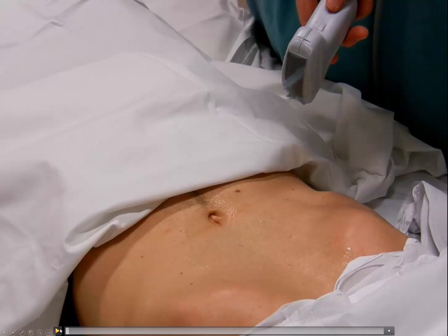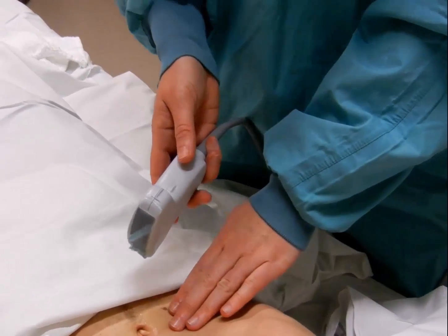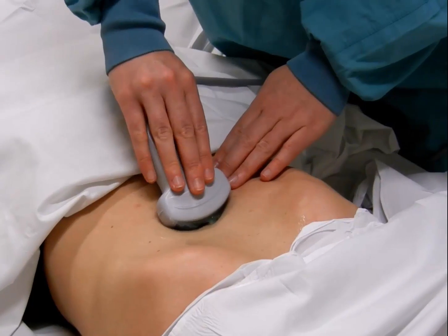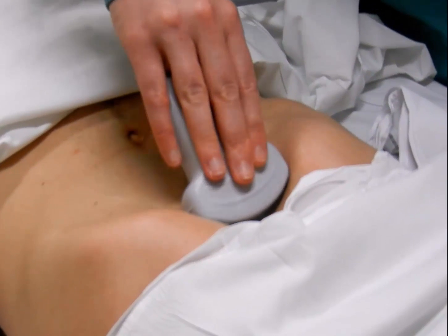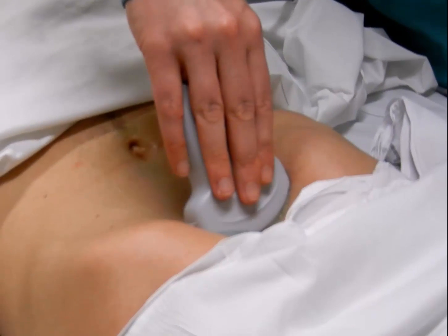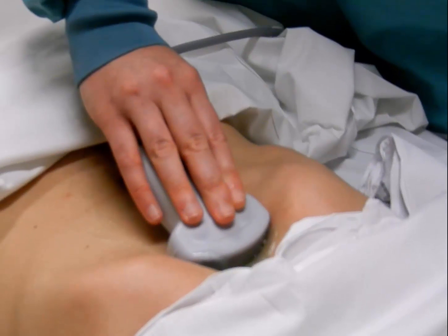The ultrasonographer will first place their hand on the umbilicus and then place the probe with the probe marker facing the patient's right, directly above their finger. As the probe approaches the xiphoid, the ultrasonographer looks at the ultrasound screen and tries to identify the sonographic landmark.